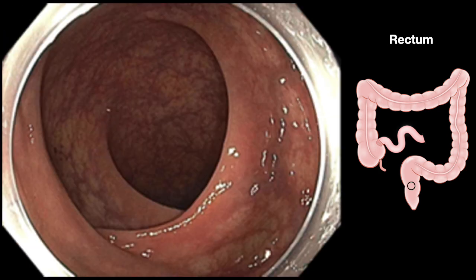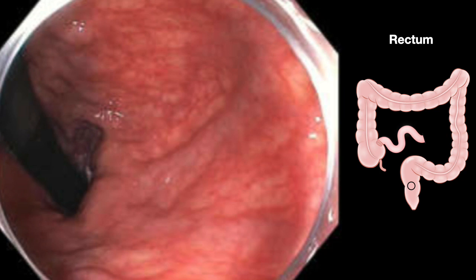And then once you come into the rectum, you see the 3 valves of Houston. I'm based in Houston, and for the sake of understanding, these valves are called the valves of Houston in the rectum. And when you do the retroflexion, you see the scope turned back and looking, and these are the inferior rectal veins draining into the hemorrhoids.